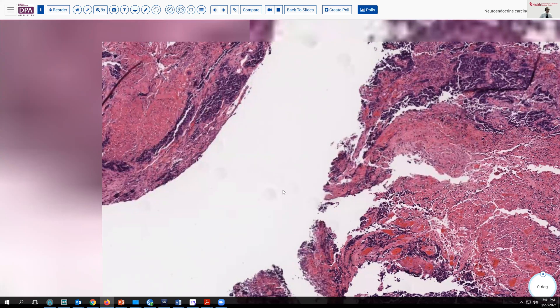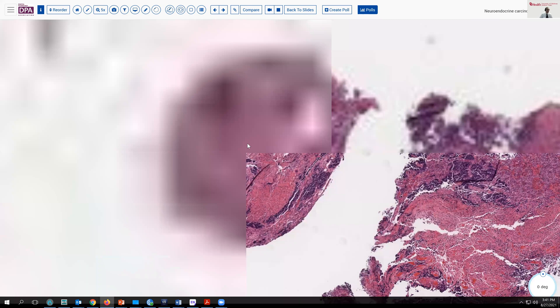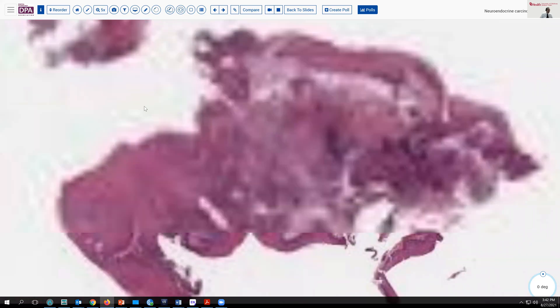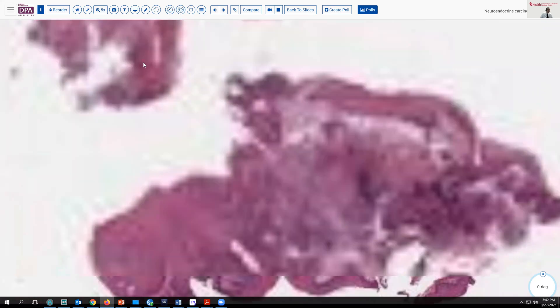We'll move our way up to the furthest most area of the slide here. This reminds me to let you know that you can come back and study these digital slides on your own computer after our presentation today.